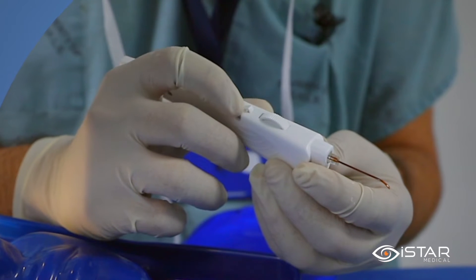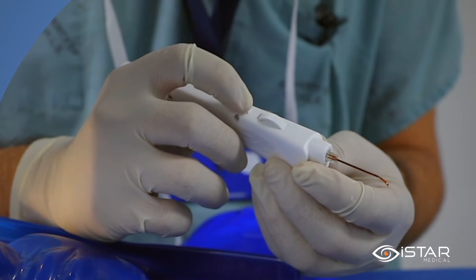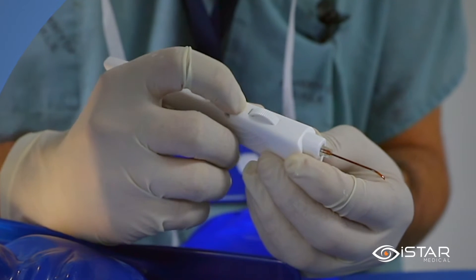To show the implantation technique, I will deliver the implant onto my finger. First, the safety is unlocked with the first digit.